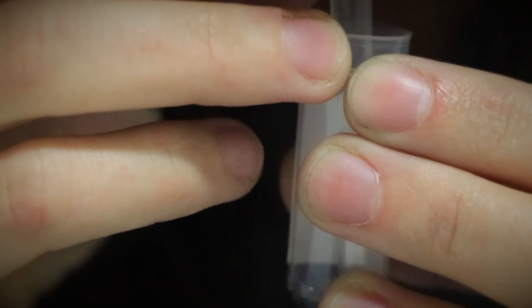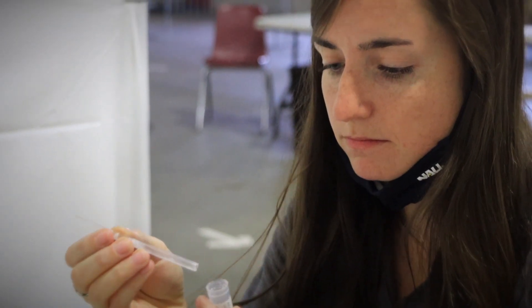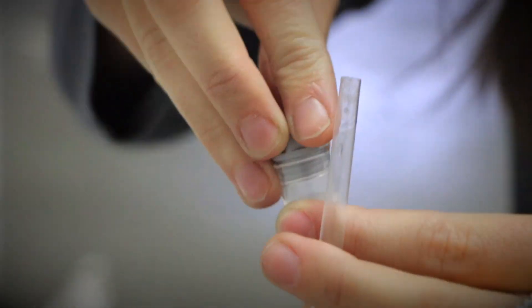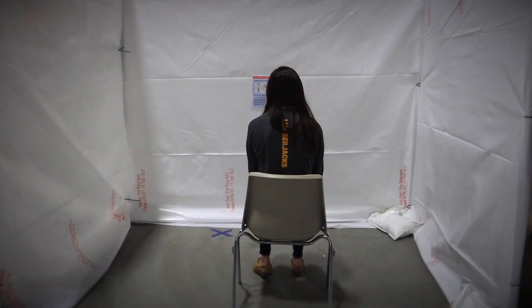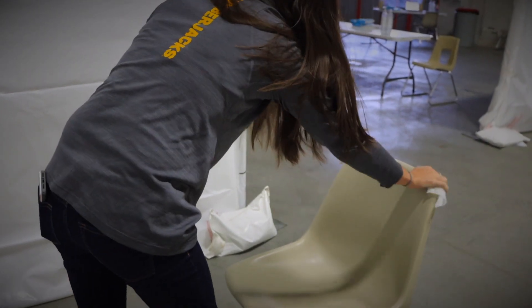This process can take five to ten minutes. Once you've filled your test tube to the line with a clear, bubble-less saliva, mask up and make sure the cap is screwed on tight. Before leaving your bay, take some time to properly wipe down and sanitize your area.